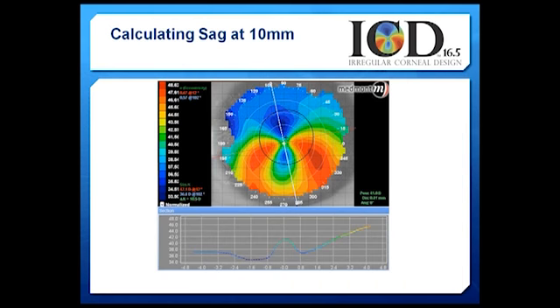Once you've selected your initial lens, then you can put it on eye. If you have a corneal topographer that measures sagittal depth, then you may have a step more accurate than using purely the keratometer and the type of condition that you're facing.